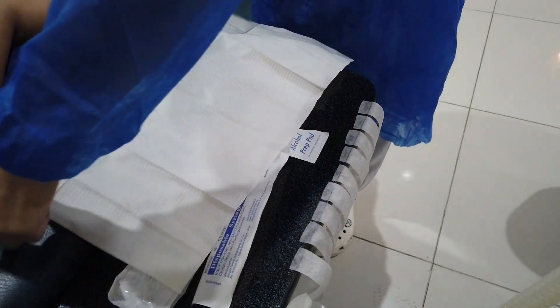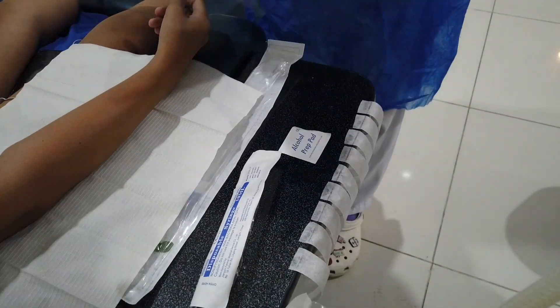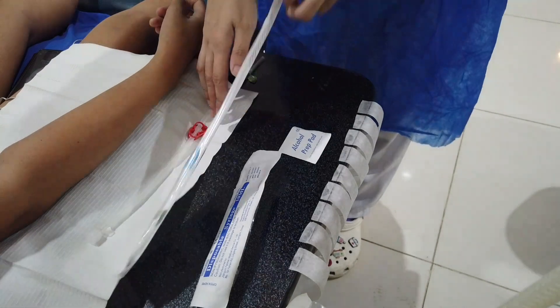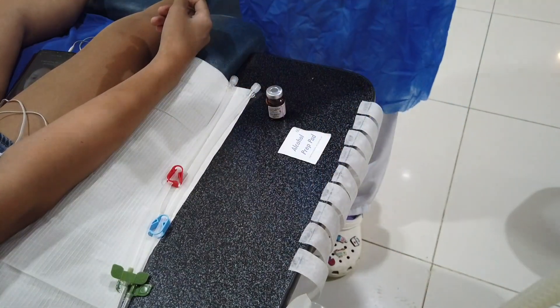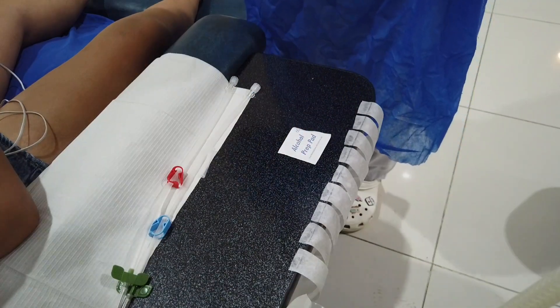Place the pad under the arms. Take out the fistula needles from the package. Make sure to unscrew the needle tube cap and lock it again to ensure the caps are securely locked and closed. You wouldn't want to see the blood gushing out to the floor — if it did, immediately close the clamp.